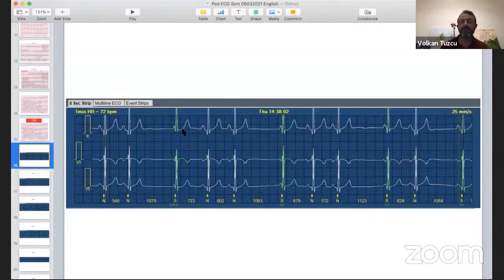If this junction was coming a little later, the P would conduct, but the AV node couldn't wait anymore, or the His bundle, and you have this junctional escape. Same here, junctional escape. All right, we understand that part, like it happened here also, here also. What's interesting is that a few times you have a certain rate for sinus, and suddenly you have a pause. Sinus pause, right? See this P comes so late. After the pause, you have this junctional escape each time.